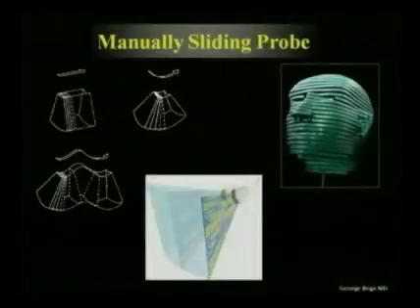Now, the freehand acquisition has been the first way to do 3D ultrasound. Freehand acquisitions typically use a normal 2D probe, and the operator will have to physically move the transducer elements over the area of interest. While this seems like a nice, economical and easy way to do 3D ultrasound, it is prone to artifacts.